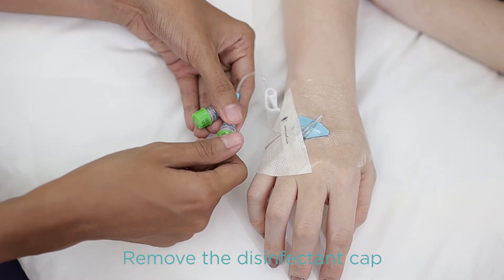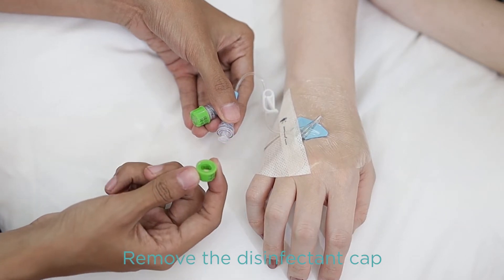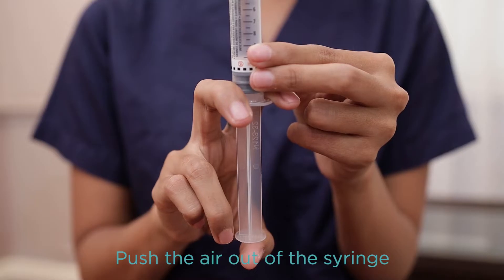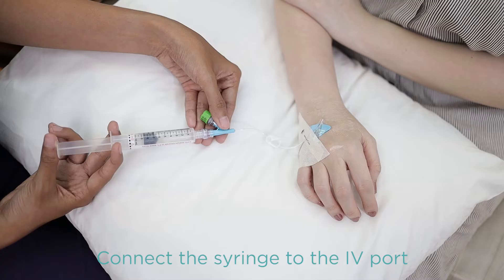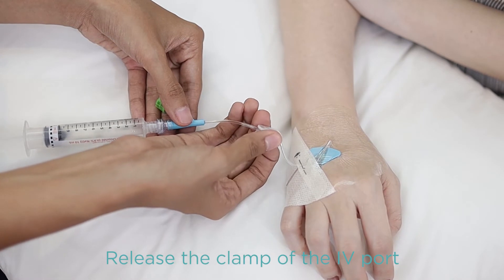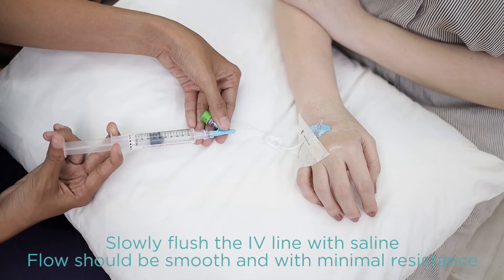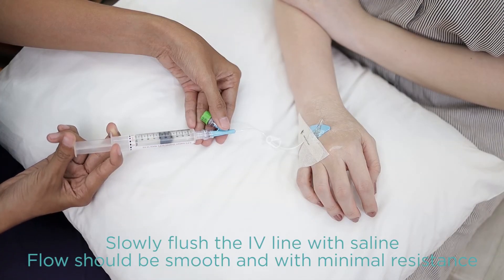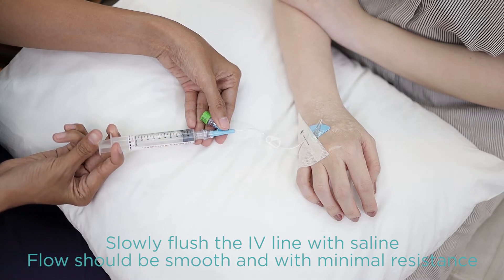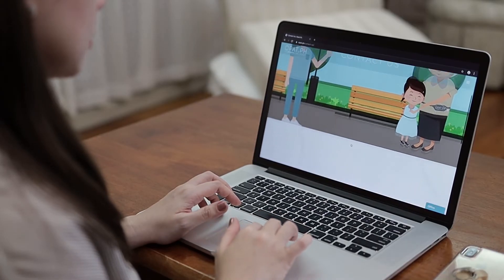After checking all the details, remove the disinfecting cap from the port connector of the peripheral IV line. Next, prepare the pre-filled syringe by pushing the air out and connect it to the port, then release the clamp of the extension tubing of the peripheral IV line. Slowly flush the port connector with a pre-filled saline syringe. The flow should be smooth and with very minimal resistance. If otherwise, call OPAT.PH for further guidance.